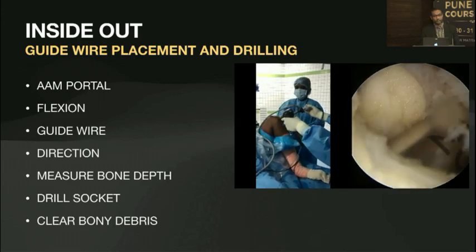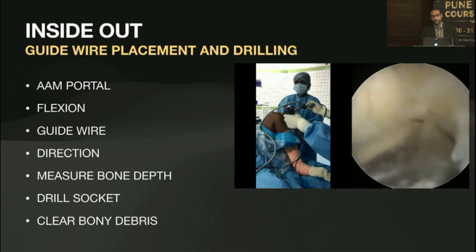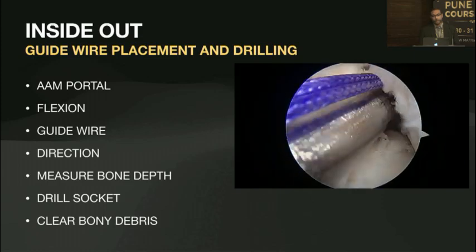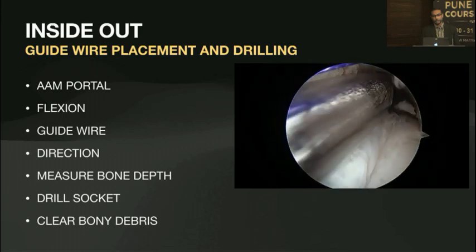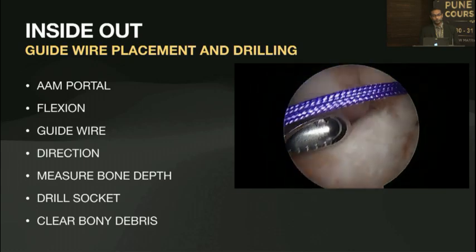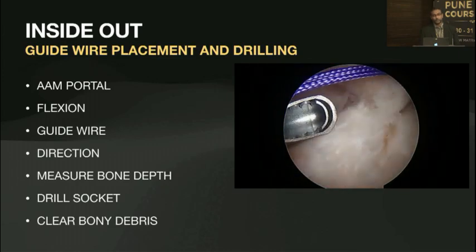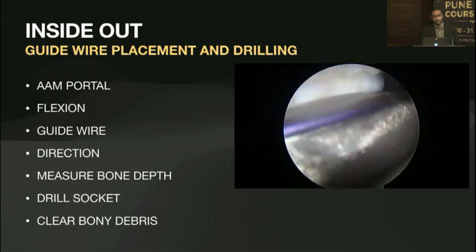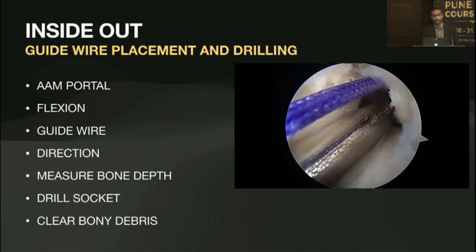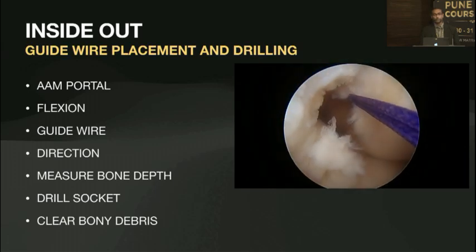Depending on the length of the graft and whether you're using a fixed or adjustable loop, cater the tunnel depth accordingly. When you ream back, slowly clear all the bony debris. Use a shaver and clear off the bony debris again — bone debris can be found all around the knee joint and can cause secondary injuries to the condyle surfaces. Make sure you visualize the tunnel from the anteromedial portal, confirm there's no bony debris, you've got a good posterior wall, and there is no breakout at the lateral side.